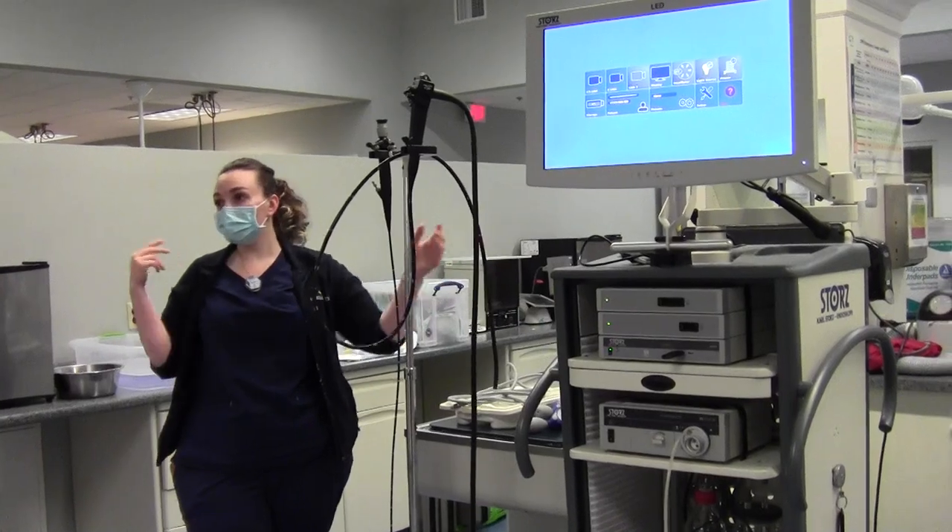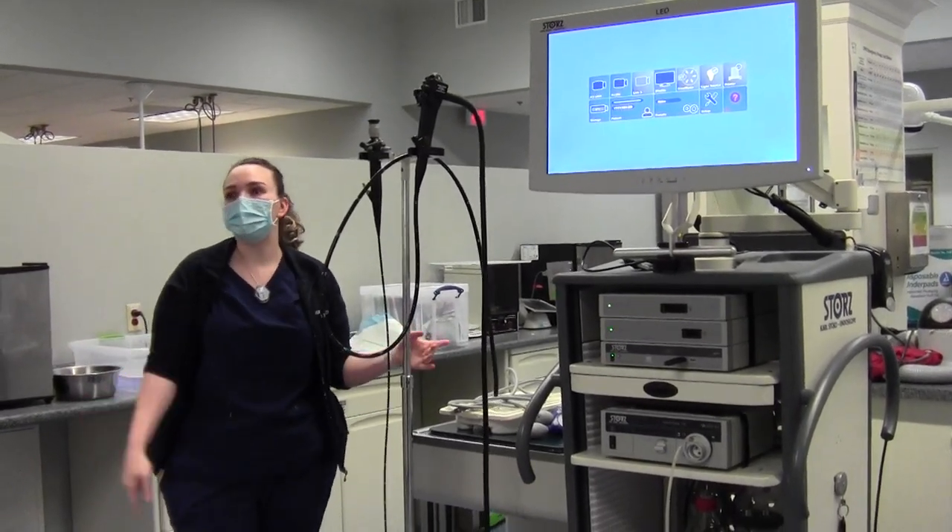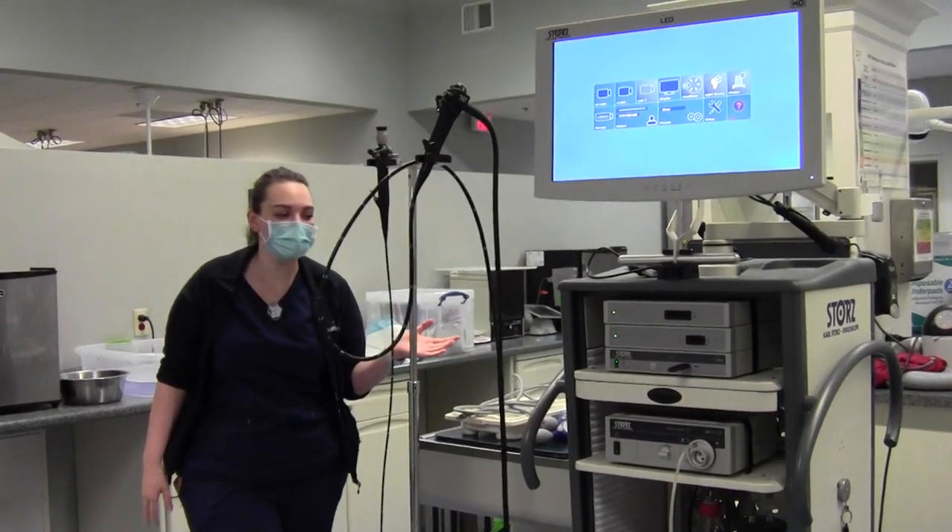For foreign bodies and regular endoscopy, we don't ever really use the colonoscope to go up the butt because it's dirty.